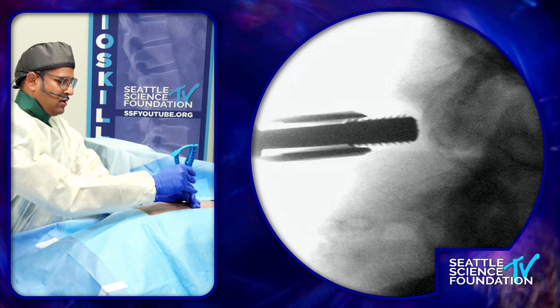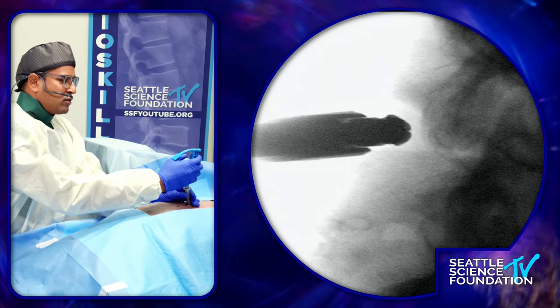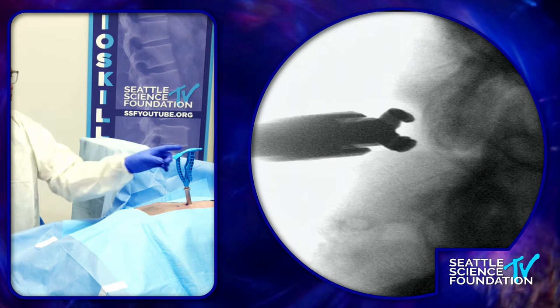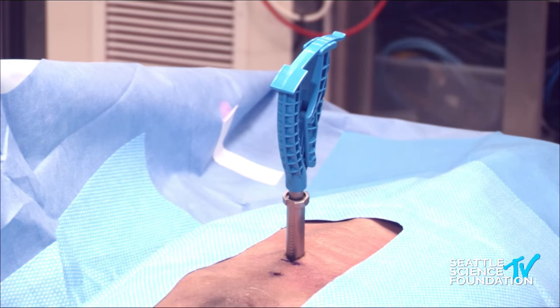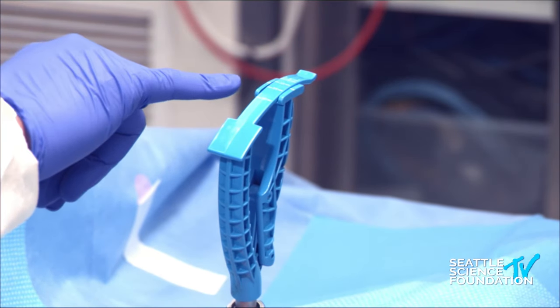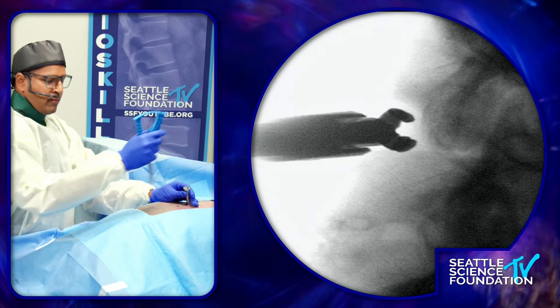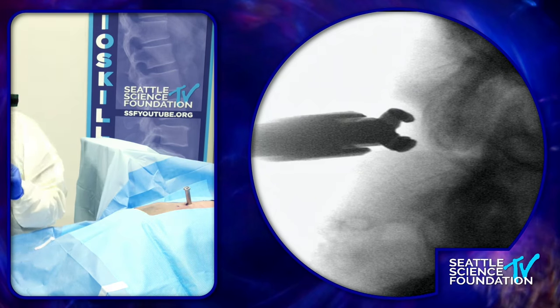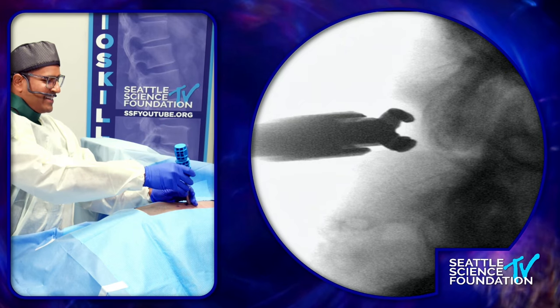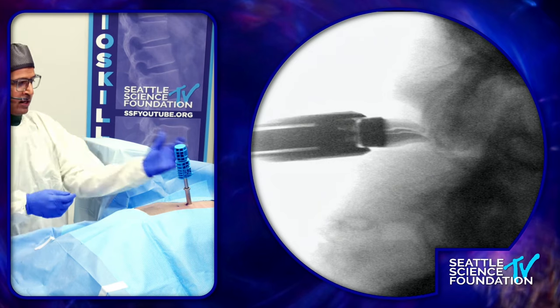This is called the interspinous gauge. I just take it past the black line — I haven't opened it yet, just showing where it's going to open. Notice that little notch in the superior spinous process; that's where I'd like my Superion to lie. Even though it's not touching the bone, that's okay — you can see this bar is bending up at the tension point. We're not trying to create flexion; we just want it to sit and be an extension blocker. I can see it's between 12 and 14 millimeters, so I'm going to size down and do a 12 millimeter. From the IDE study, 14 millimeters was most commonly used, but surgeons may have been a little overzealous; 12 or 10 is really what we see now.